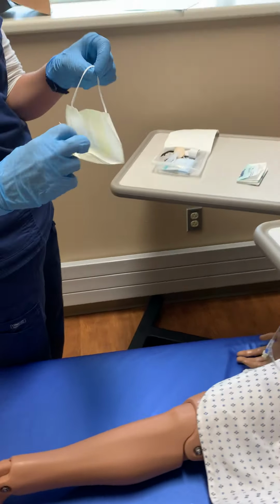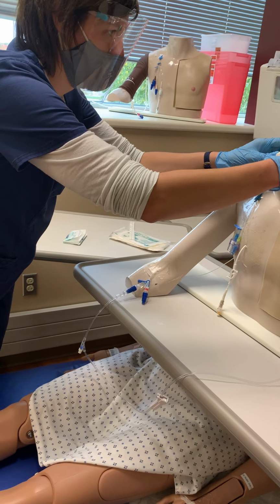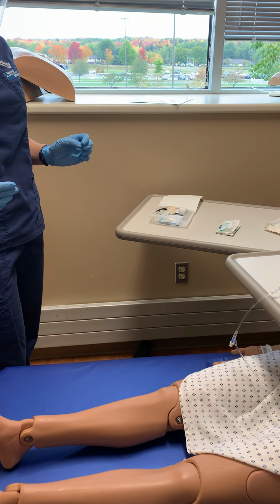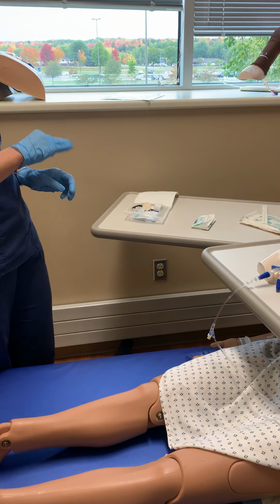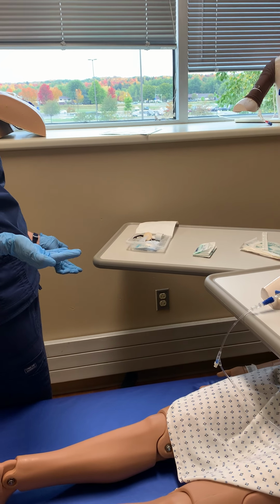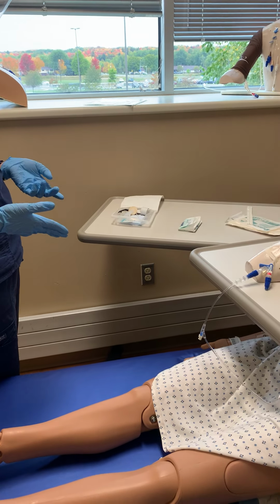And then I will put this on Frances. Okay? And we're going to keep that over your nose and your chin. Okay, now my sterile field is open, so I'm going to be extra careful not to contaminate that while I move forward here. So I don't want to turn my back to it at any point.